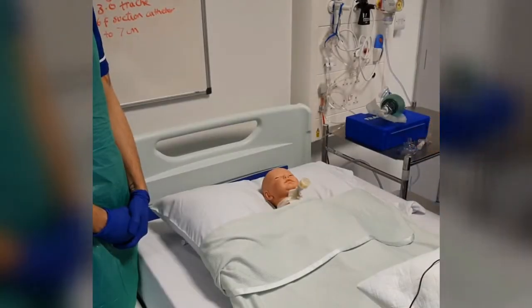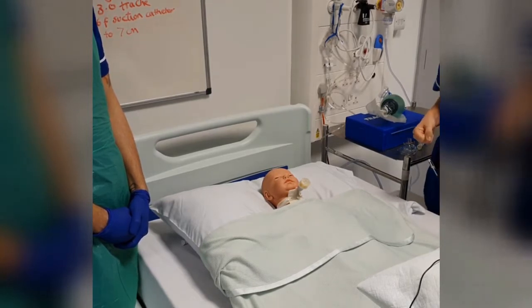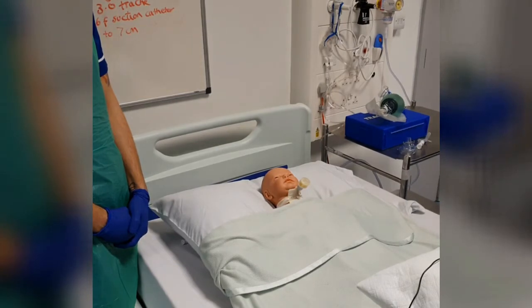So Sam, we're now going to use one of our mannequins to talk through the emergency algorithm. We're going to start with looking at a dislodged tube. So the first part of the algorithm is the safe approach. So we want to check that our area is safe and if necessary, shout for some help.